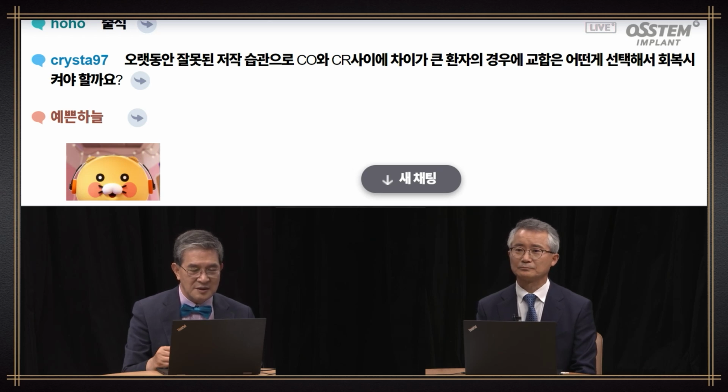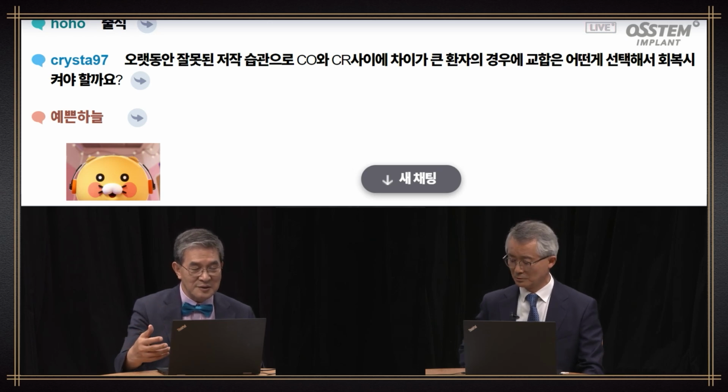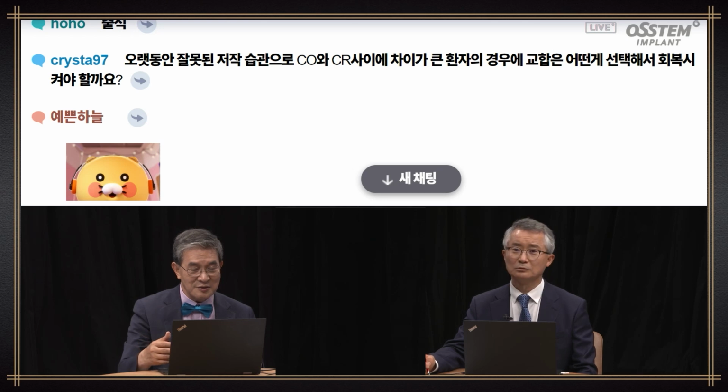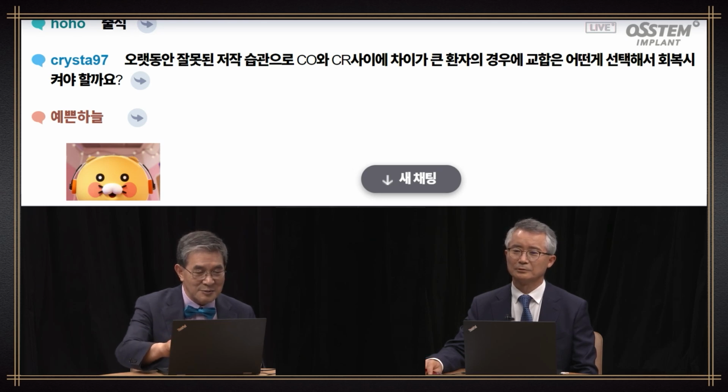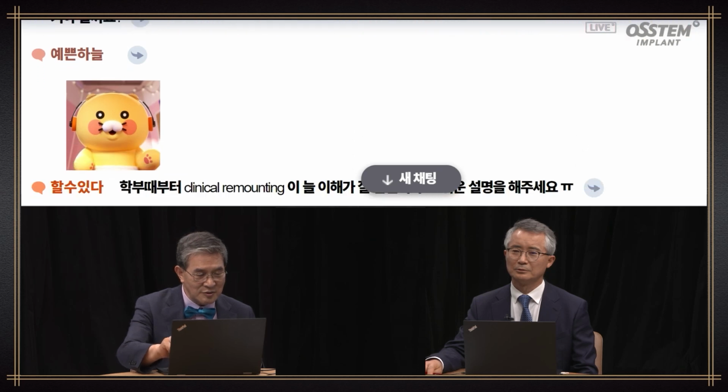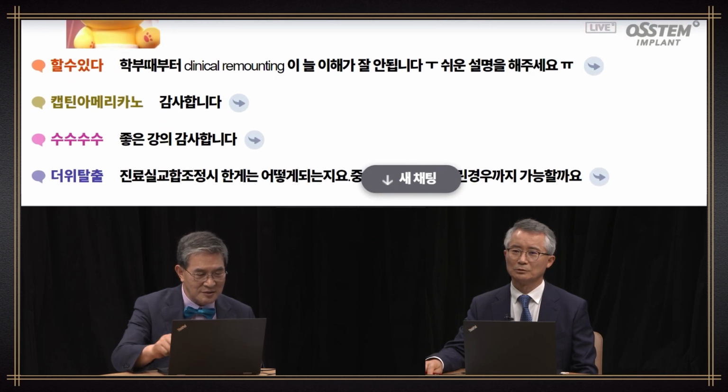Difference between CO and CR. I think this came to be because of using an old denture and because of long-term habits. We need to make sure that it becomes a CR to CO. If it is difficult to do this, then we can fabricate a treatment denture to correct the occlusion and then provide the final denture. That's what is written in the textbook. However, if the difference is not significant, you can provide the prosthesis right away as well.